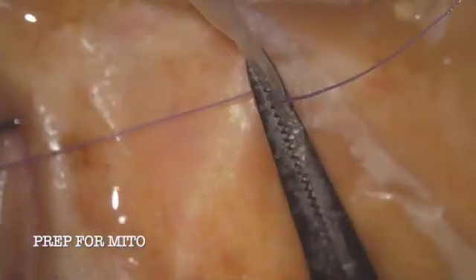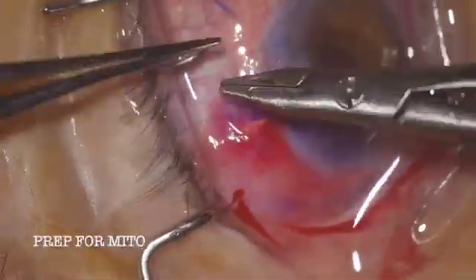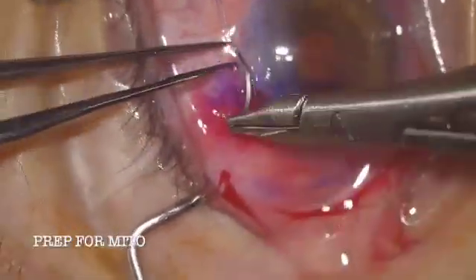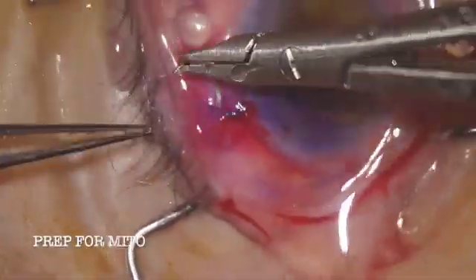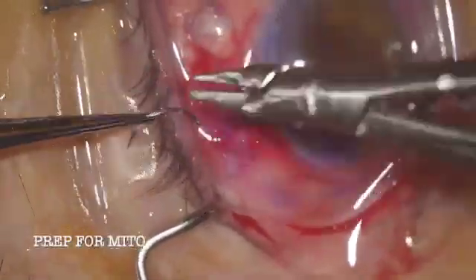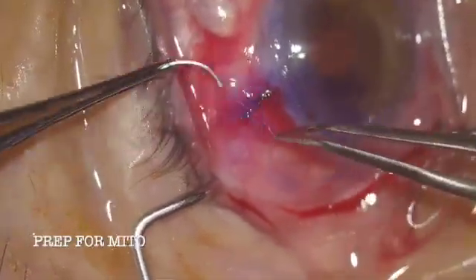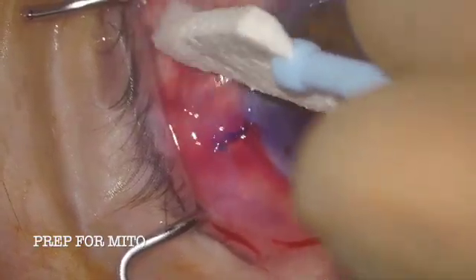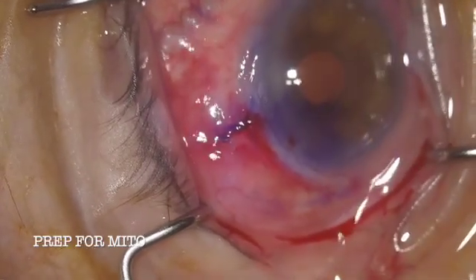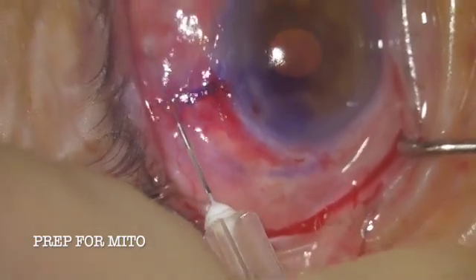With the Xen placed, we'll approach getting the bleb ready. To prepare the bleb I go ahead and suture my semi-open approach conjunctival incision, where I went below Tenon's to do the dissection. I like primary needling in these cases, so I do needling before placement of the Xen using the iris sweep. Then after placing the Xen, if I'm not satisfied that it has enough of a formed bleb area, I'll needle again with the iris sweep or a needle to make sure I'm happy.